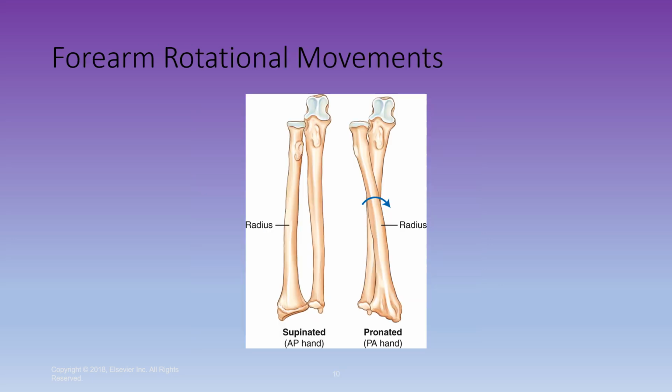Moving on, as far as the rotation of the forearm, this is on page 132. Okay, and the rotational movements, they tell you that generally the forearm is absolutely not radiographed in a PA projection.